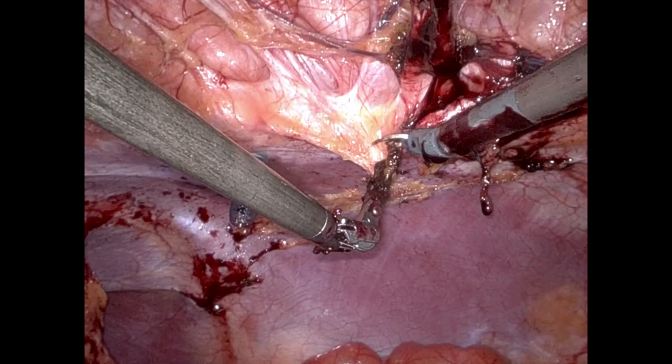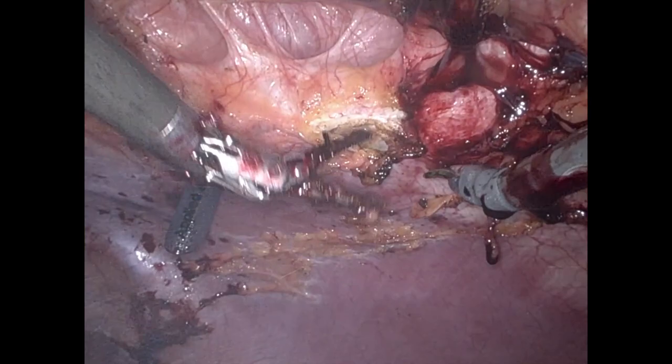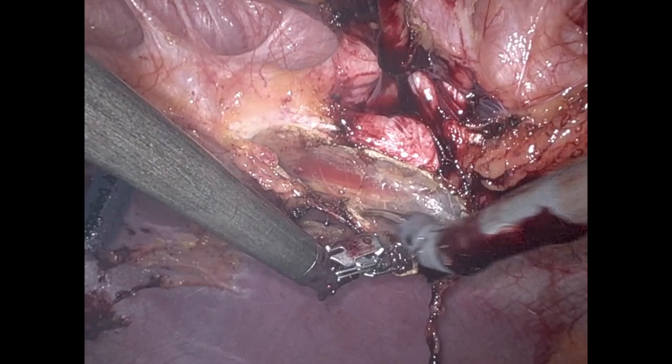After the lysis of adhesions was completed, we started with a standard retromuscular repair. We'll go ahead and show the quintessential elements of this operation, starting by entering into the retrorectus space on the patient's left side.